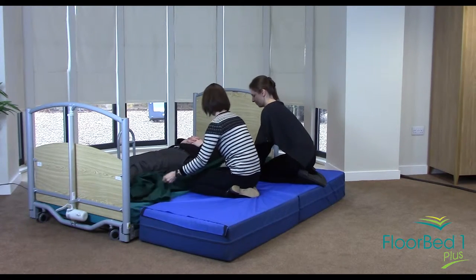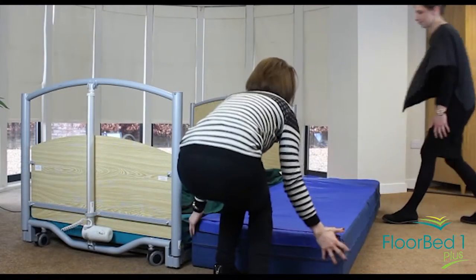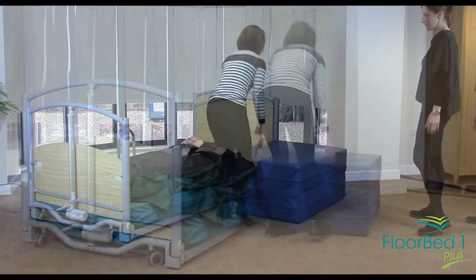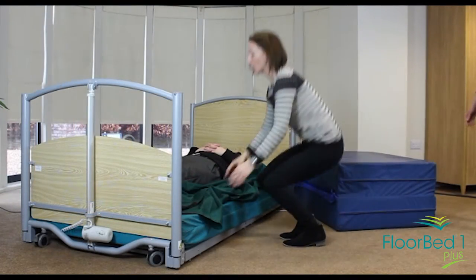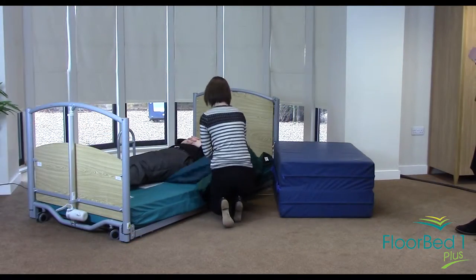The mat is now safely on the bed. What we will do is come off, remove the safety mat if you need to — this can be folded and moved out of the way — and it also allows you good access to then take the sliding sheet out from underneath.